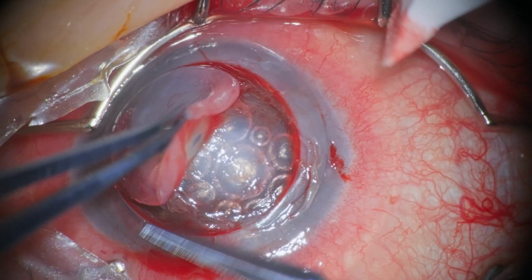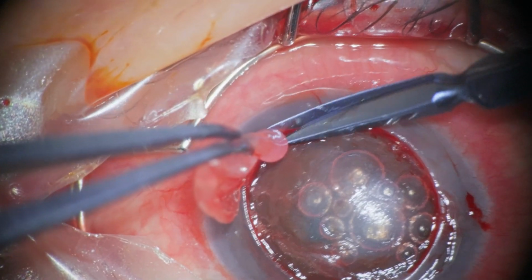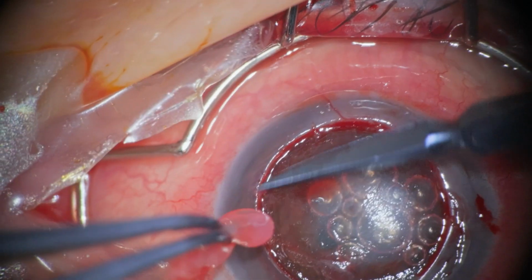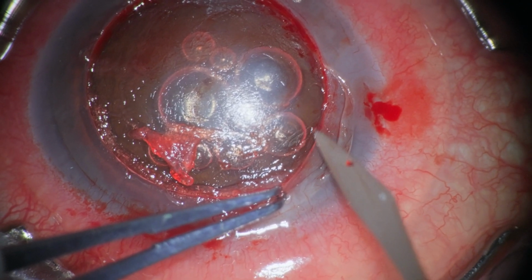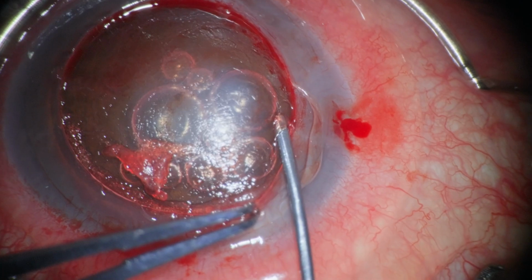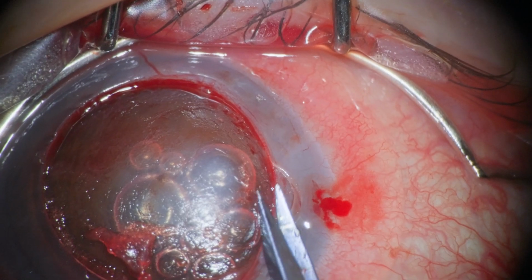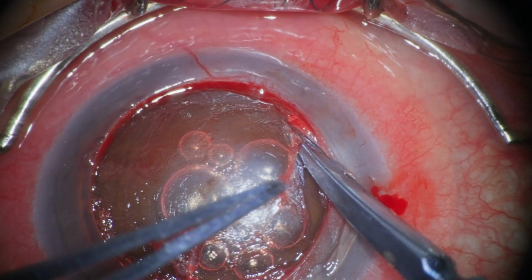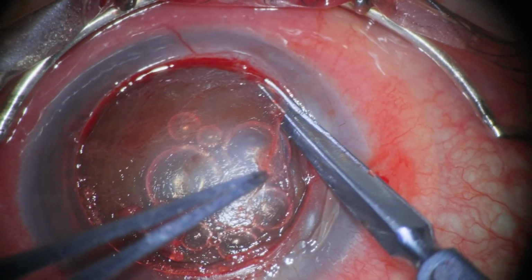In these cases where there is dense opacity, a scar is always encountered, and that needs to be dissected if possible to separate Descemet's from the scar. If there was no prior perforation, then Descemet's is not involved in the scar, and probably you can get away with finding the proper plane. Now we're trying to deepen our plane because, as you can appreciate, there is haze formation and scarring in the central visual axis, and there's no point in leaving the cornea like this. We're lucky in finding the Descemetic plane.